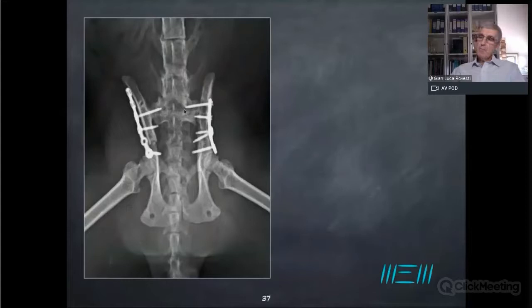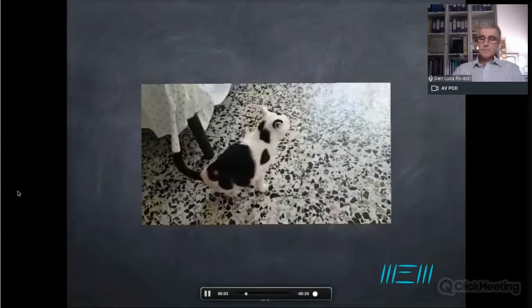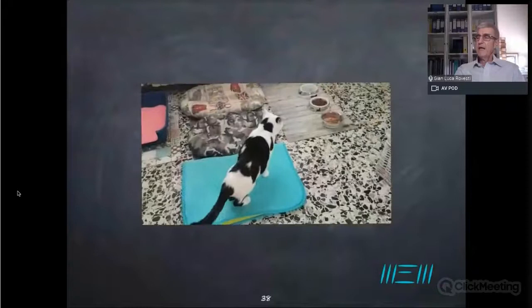And look at the diameter of the pelvic canal. We didn't lose any diameter of the pelvic canal. So this is a good healing process. And this is the cat after a couple of months. Still not perfect, but doing better at home. Okay, dealing with this kind of lameness, but still in good health.